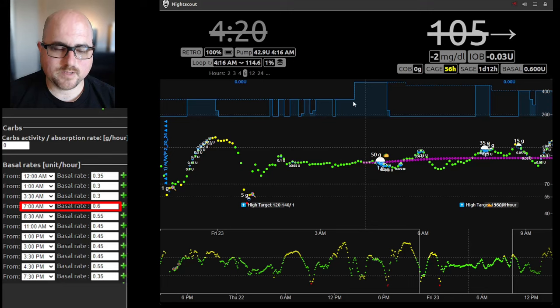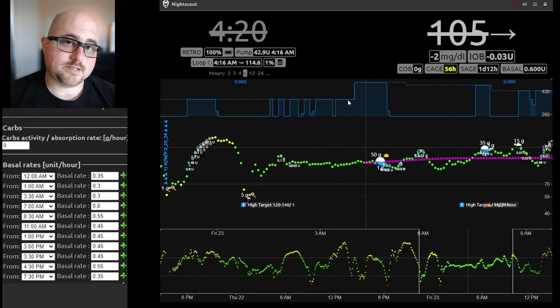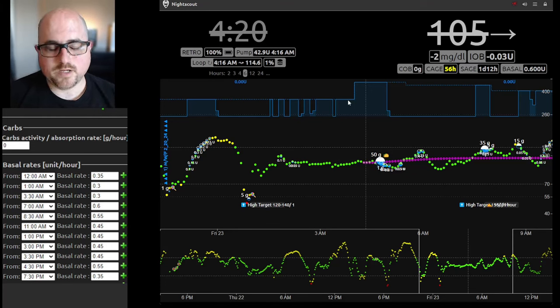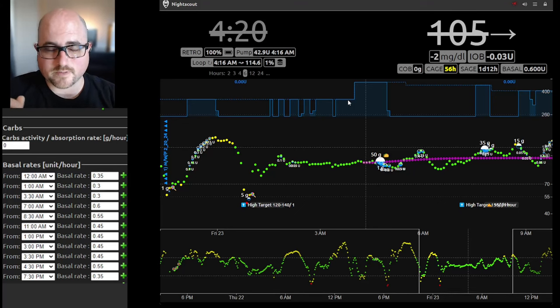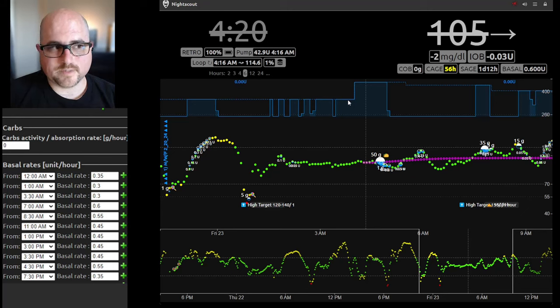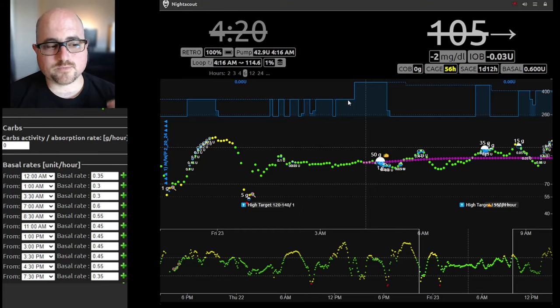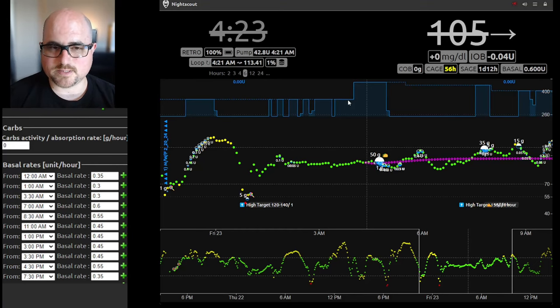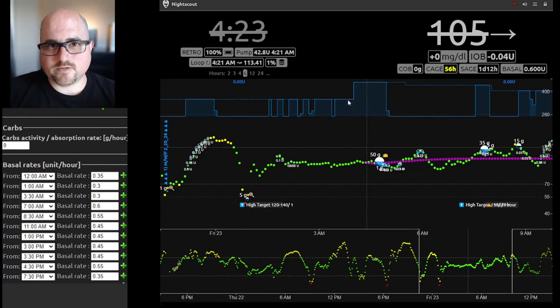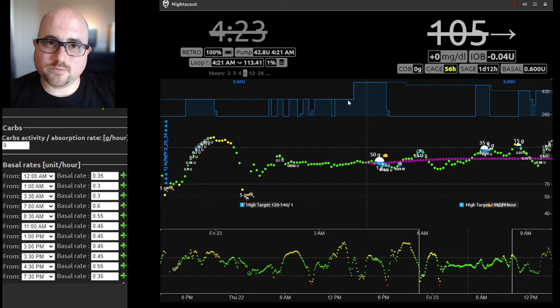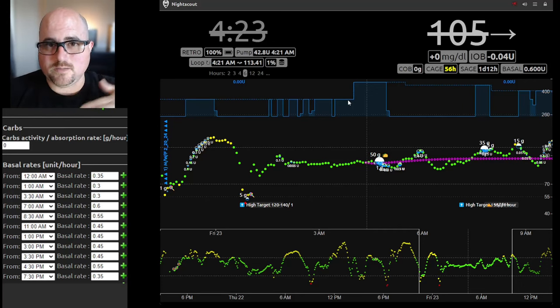My rule of thumb is to go as few basal rates as possible, and the night and the day are usually really close together — either the same or very close. There are rare instances where that's not the case, things like stress at school. So we start with basic. If what's working overnight is working, then generally speaking you would run that rate or something lower during the day. I find that, especially for kids, you have growth hormones and other stuff going on when your body's repairing and growing — that seems to be why we need a little bit more insulin overnight. So the basal rate that works for nighttime should be the same or lower during the day as a starting point.